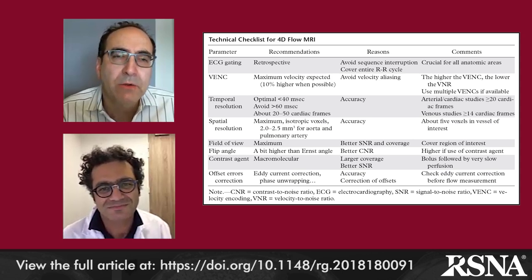Right. Terrific. Now, obviously, in looking through your paper, there's considerable pre- and post-processing of the data sets that are necessary to properly display the data for visual and quantitative flow analysis. Let's take a look at Figure 1 as you explain how this all works from data acquisition to the final display and analysis of the data.